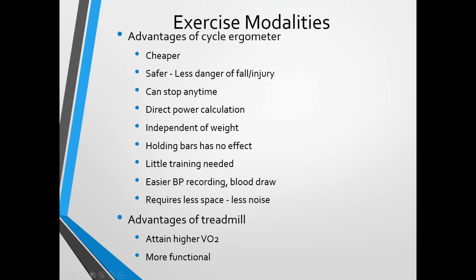The treadmill attains a higher, so it can be more rigorous with the oxygen uptake, which is VO2. Again, more functional. What they're saying about more functional is that it's more closely emulating or mimicking what you do every day: walking, fast walking.